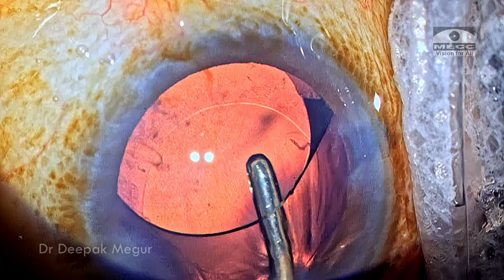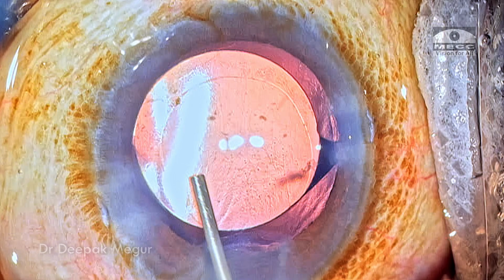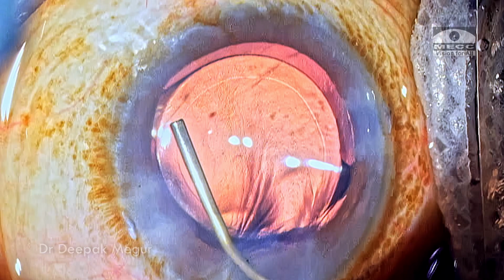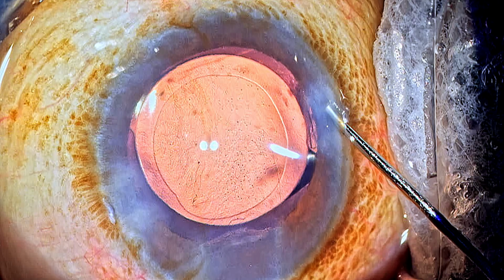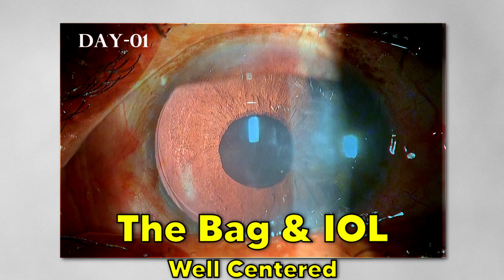And even after the OVD is removed, the lens looks to be fairly well centered. And because the anterior zonules and the bag in general look very healthy, I've aborted the idea of putting in a CTR, and it looks fine. And in the post-op period also, there were no issues. The patient continues to do well.